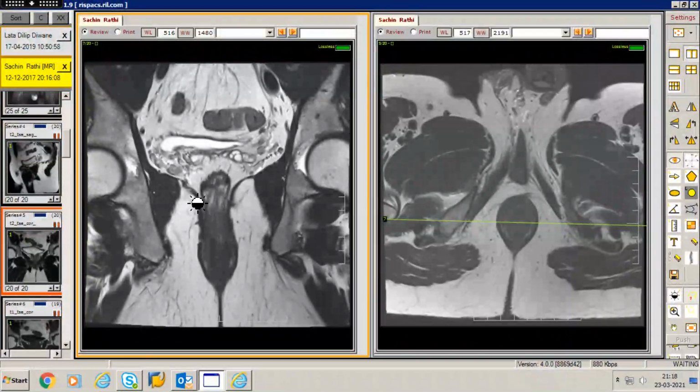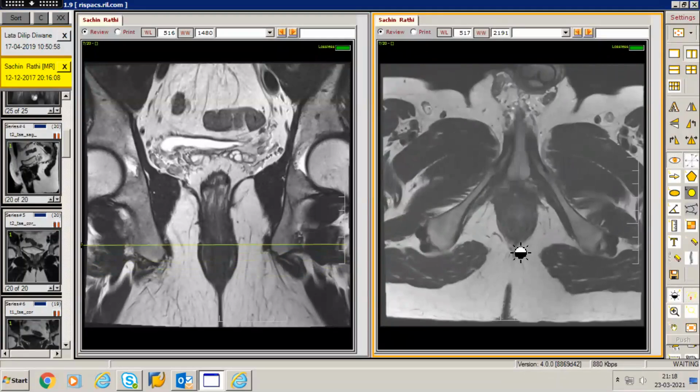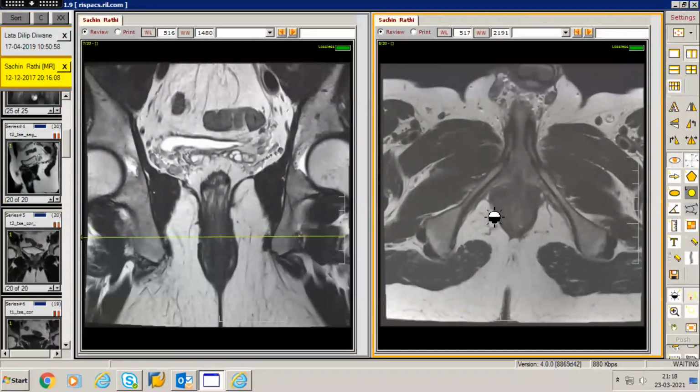So the levator ani has multiple components, but what is more clinically relevant to us would be the iliococcygeus component, which attaches from the endopelvic fascial reflection of the lateral pelvic wall, coming and inserting inferiorly into the puborectalis muscle here. At the same time, if you were to appreciate the same thing on the axial images, you can appreciate this slender, U-shaped sling-like structure, which is extending from the level of the pubis and at the same time forming a sling around the rectum and the anal canal. This would be the puborectalis sling itself.